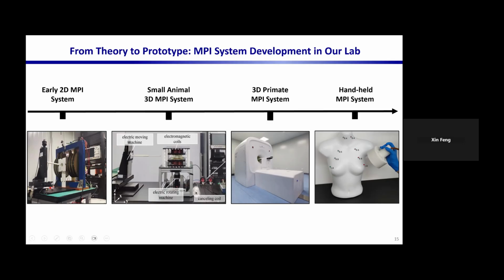And then moving forward, our primary goal is the clinical translation of this technology. So we're currently focusing on developing systems tailored for clinical use, including the handheld system that we're showing here. And we're also developing another single-sided device designed for localized imaging of specific body parts.